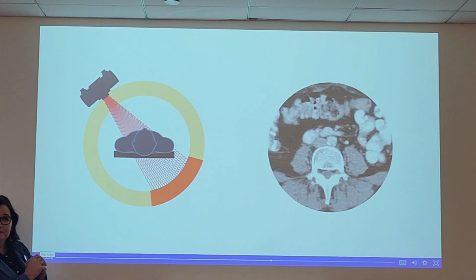So basically, the X-rays. The image just kind of shows they've been attenuated, and so what you're seeing is just the leftover.